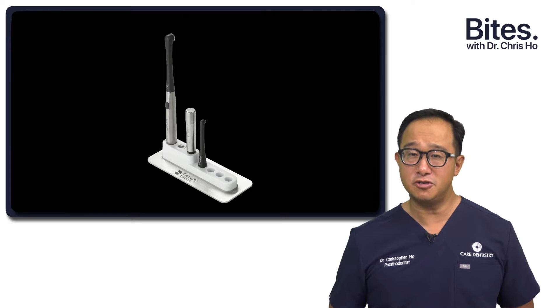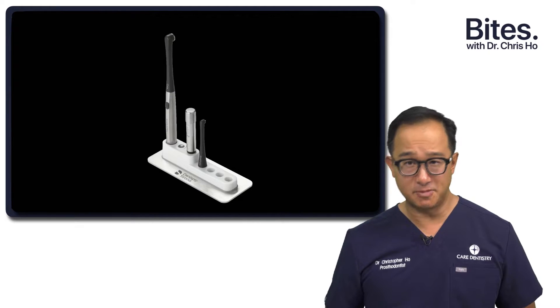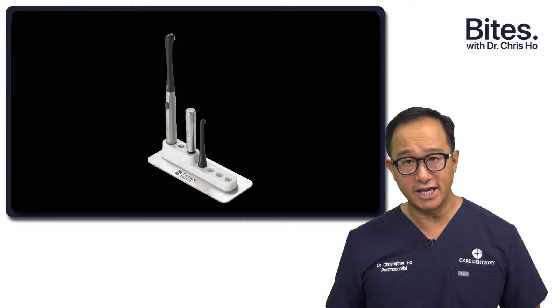Today, I want to show you this new curing light by Dentsply Sirona, the Smart Light Pro, and why I like it in my hands.